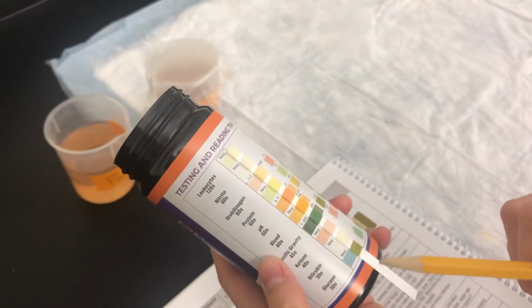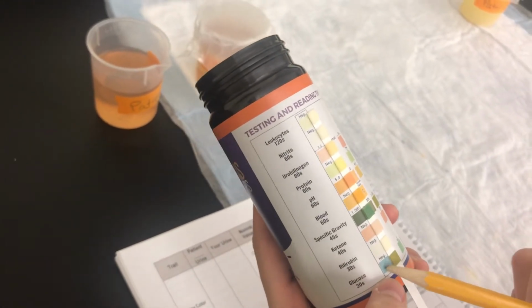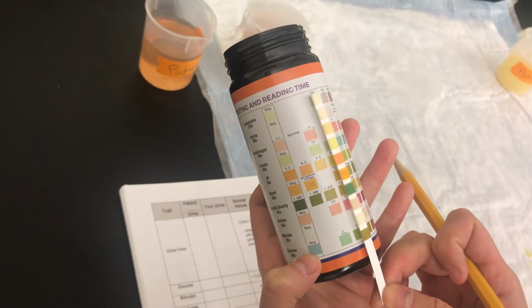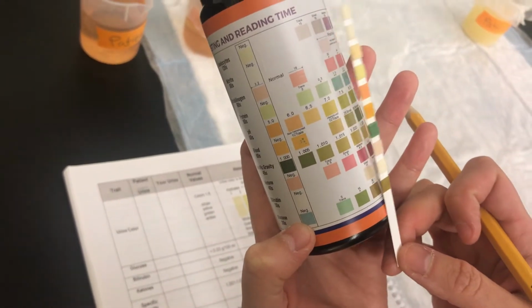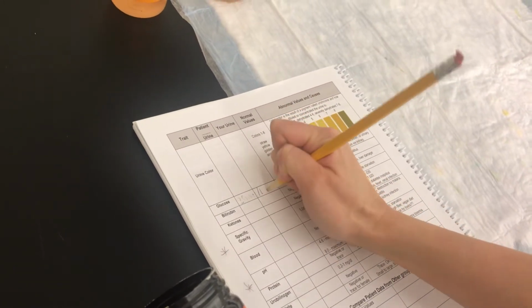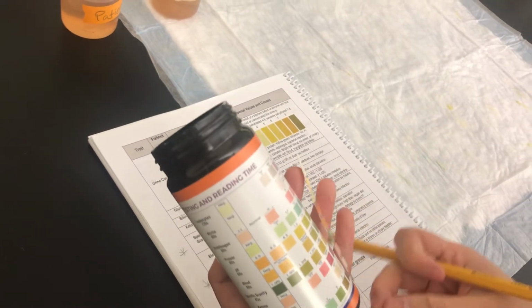Okay, so here glucose does not look blue, right? If it looked blue, you would know that there was nothing wrong with this particular sample. So I'm going to move it to the right until I see something that looks kind of like this color. Okay, so it looks kind of brownish, and that's 30 millimoles per liter. So that's plus plus. So that's my glucose, 30 millimoles per liter. Okay, so that's not normal, right? If you take a look at your values.